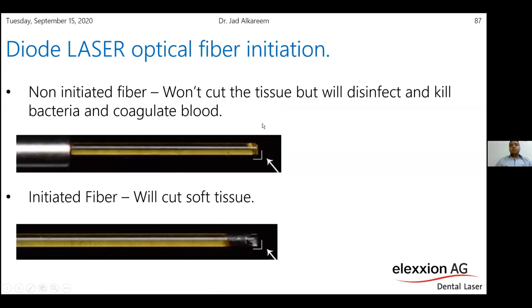The non-initiated fibers mean that the fiber is not going to cut the tissue, but it will disinfect and kill the bacteria and also coagulate the blood.